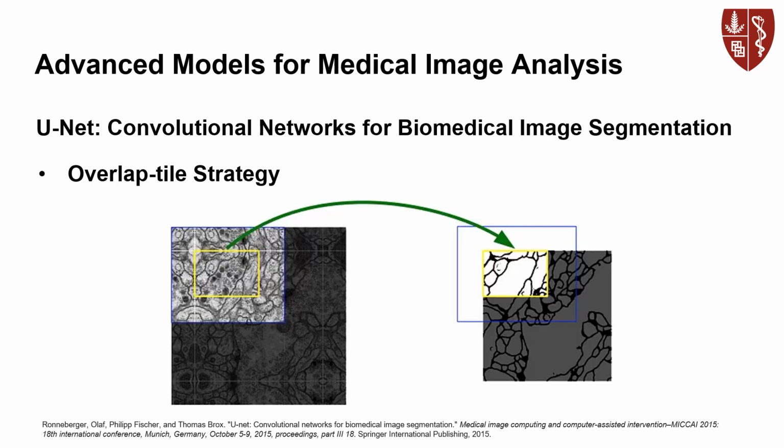And there are some techniques which UNet uses, and I'd like to talk about three techniques that would help it to excel in medical segmentation problems. The first thing is the overlap tile strategy. The problem is medical images are really large, both in terms of size and resolution. In fact, some of the computational pathology slides are close to 100K by 100K resolution. For comparison, your HD TV at home is 1920 by 1080. So just imagine how big the images are.